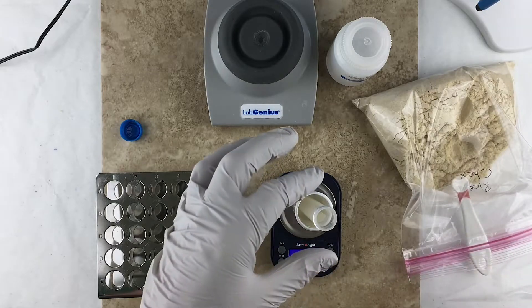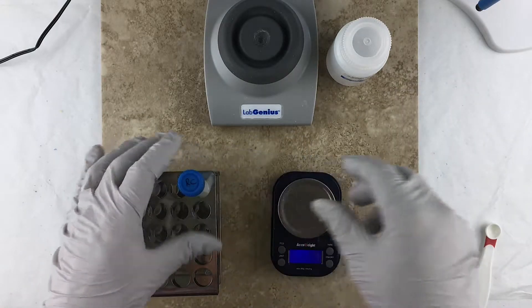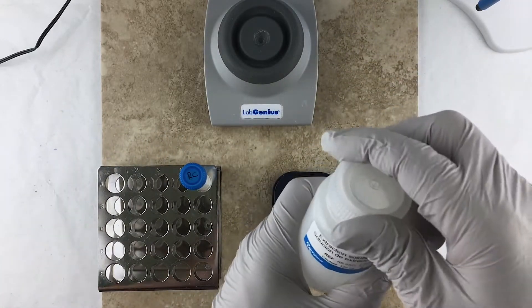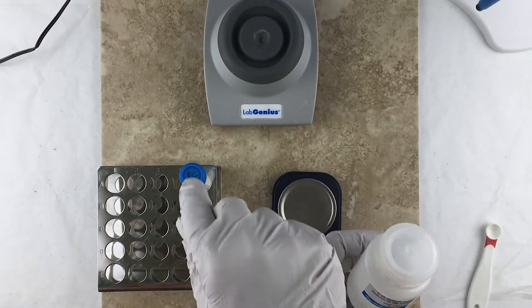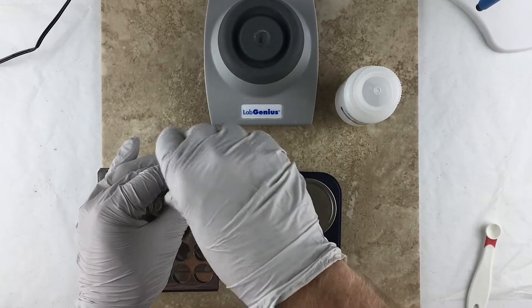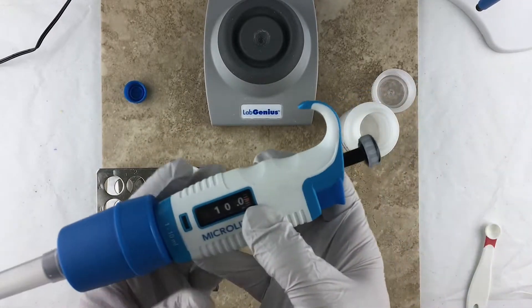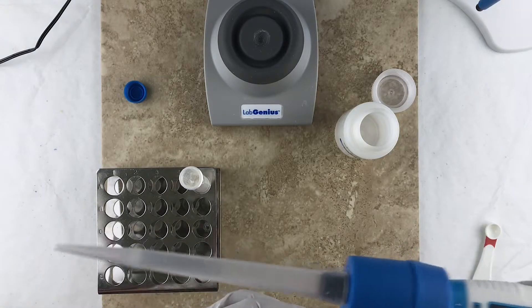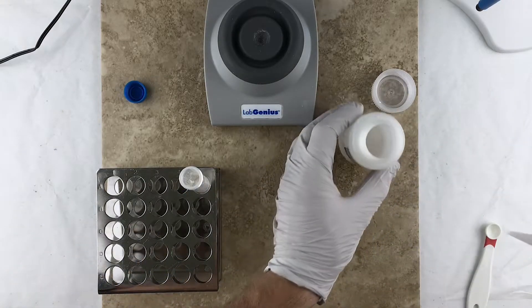Okay, there's one gram. All right, so now what needs to happen is we need to take some extraction solution and put it into the sample vial. So I've got my pipette here set to 10 milliliters, which is the appropriate amount of extraction solution.